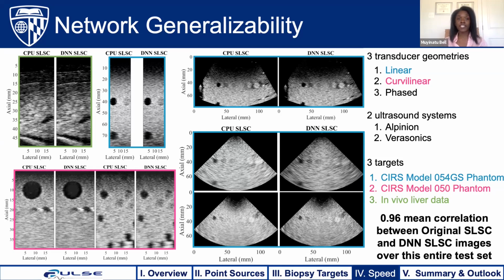And these results are very exciting because they show that we can improve the calculation of the coherence functions to improve the speed of delivering advanced coherence-based beamformers. And they also show that we can learn physics-based features from raw channel data with good similarity to the ground truth and with a high degree of generalizability across many different ultrasound systems and data types.